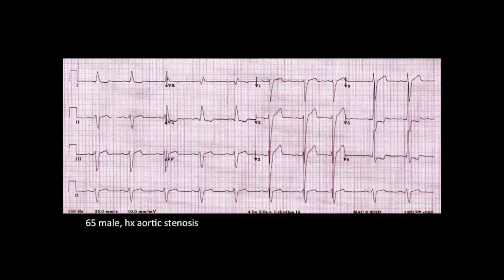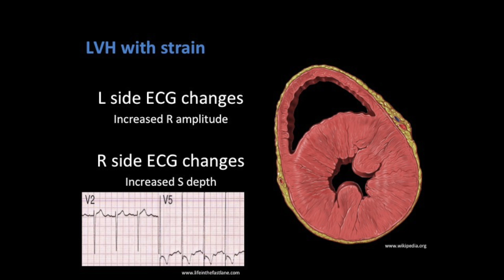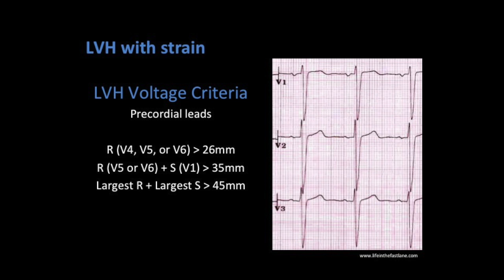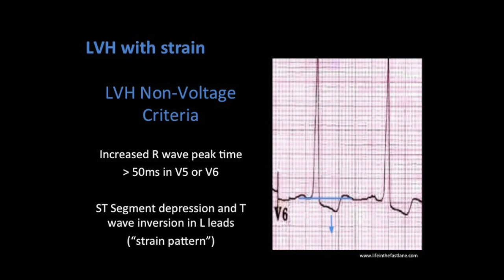This ECG is a 65-year-old male with a history of aortic stenosis. The changes here are indicative of LVH with strain pattern. In LVH, the left ventricle becomes large. The ECG shows evidence of this with left side changes showing increased R-amplitude and right side changes showing increased S-depth. There are multiple voltage criteria which can be used in the limb leads and precordial leads to determine if an ECG is showing LVH — I don't think it's important to put all these to memory, but definitely have them handy. There are also non-voltage criteria including an increased R-wave peak time and the strain pattern, which is ST segment depression and T-wave inversion in the left-sided leads. This can often be mistaken for ischemic reciprocal changes.